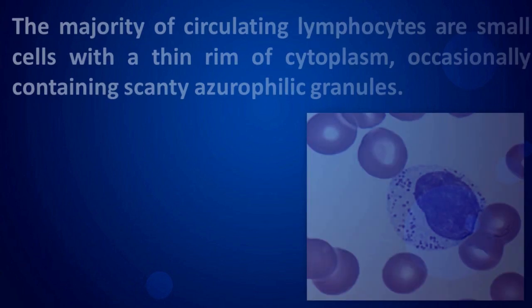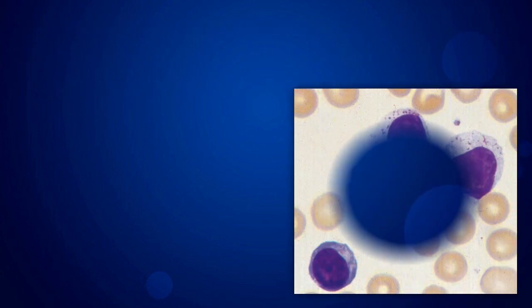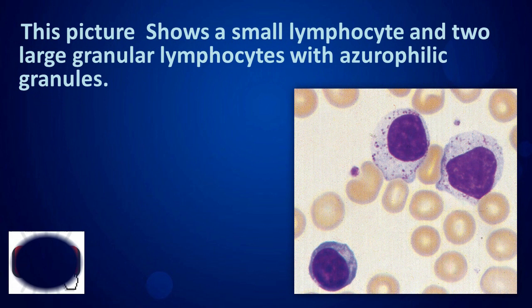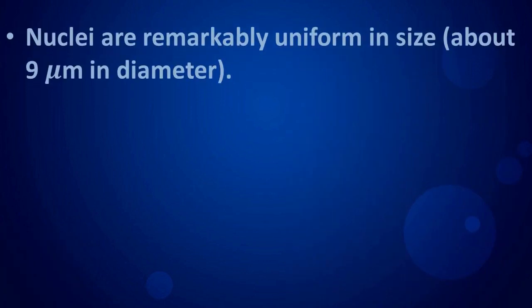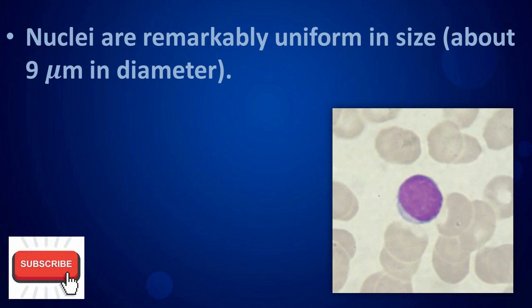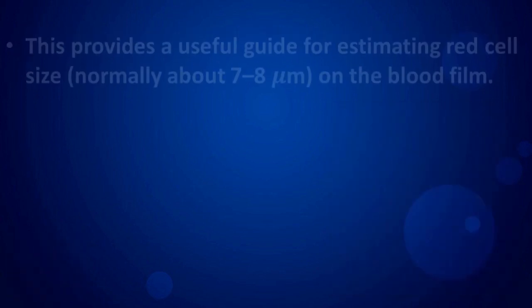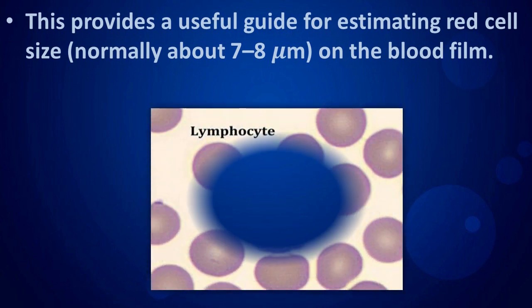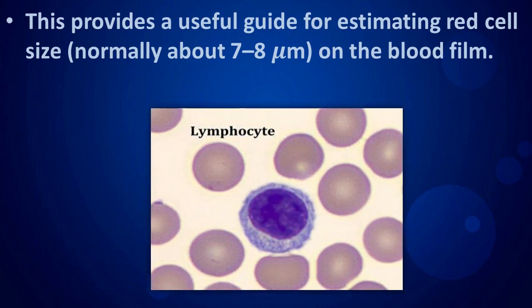This picture shows a small lymphocyte and two large granular lymphocytes with azurophilic granules. Nuclei are remarkably uniform in size, which provides a useful guide for estimating red cell size — normally about 7 to 8 micrometers on the blood film.